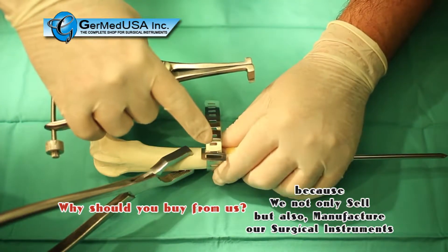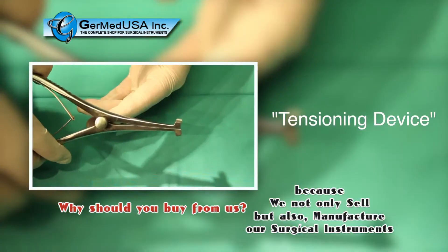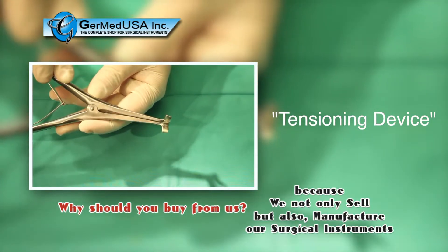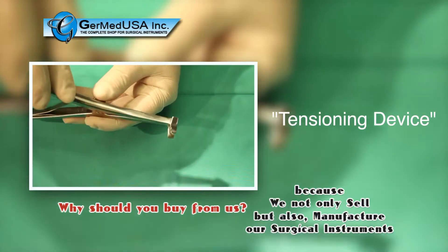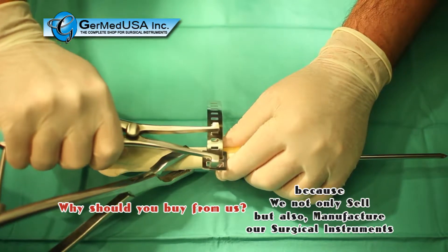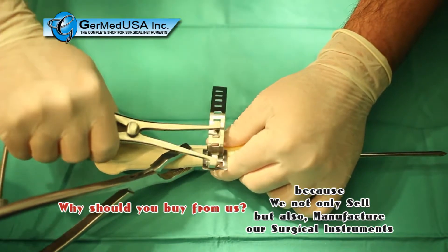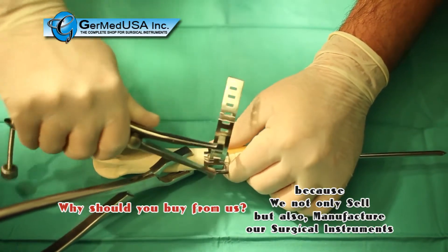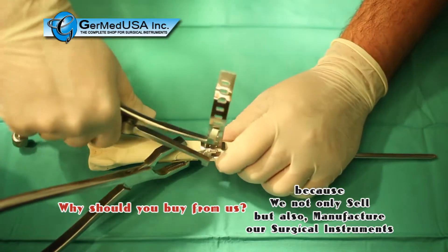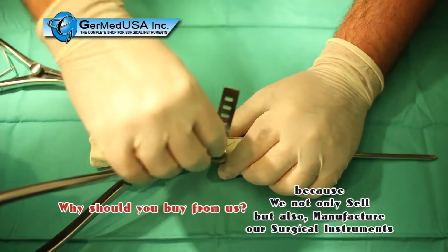Final tightening will be achieved with the aid of the tensioning device. The tensioning device is engaged into the slots of the band and the slot at the top of the buckle. The handles are then squeezed to the desired tension. If the optimum tension is between slots, squeeze to the next tightest slot, as under-tensioning will result in failure of the fracture. Rotating the handles of the device will allow the slots in the band to engage the tab in the buckle, seating the device. Remove the tensioning device and use digital pressure to complete the bend.